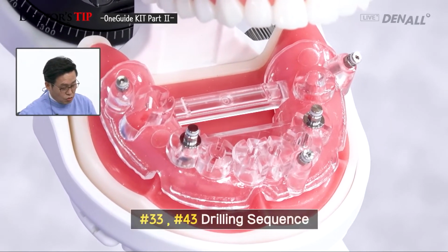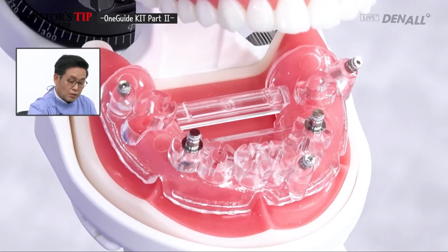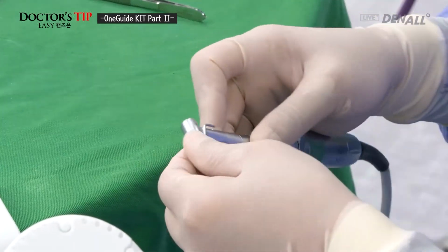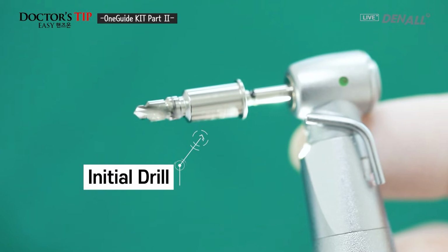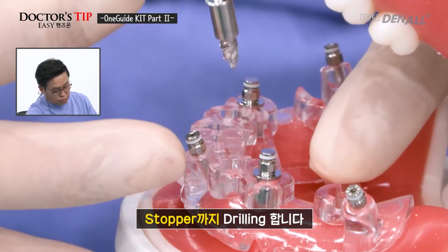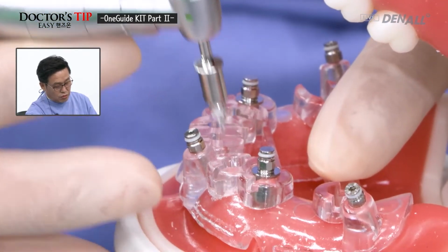The canine of both sides, if you look here, initial drilling is going to be done. 3.5 millimeter initial drill is chosen. Canine area of both sides. From number 43, initial drilling is going to be done. It is in contact with template and you need to drill to full length. This is the same, drill full length here, and initial drilling is done.